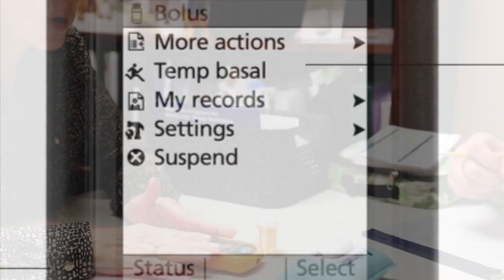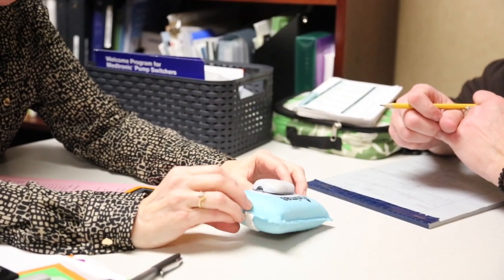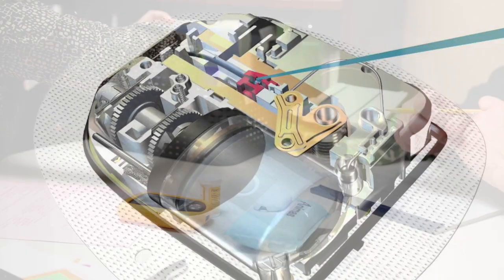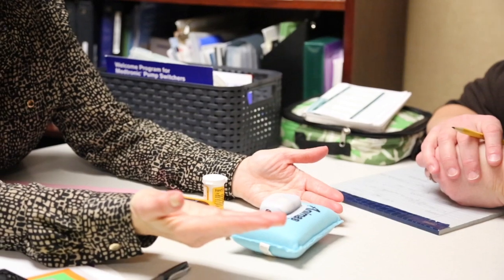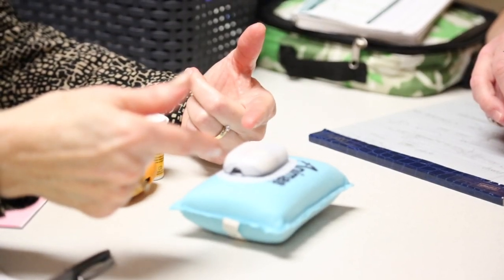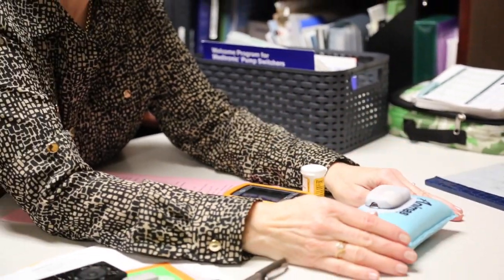Okay, but even that minute is something. When this goes into place on your body, your PDM will instruct this pod to insert what we call a cannula. It's a very short tube that gives the insulin. It goes in place. You never see the needle. Right. You feel it and you hear it. It feels like getting an injection of insulin now. It gives a loud sound. It's a little disconcerting sometimes, but I would get over it pretty quickly, because it's just one time for 3 days.